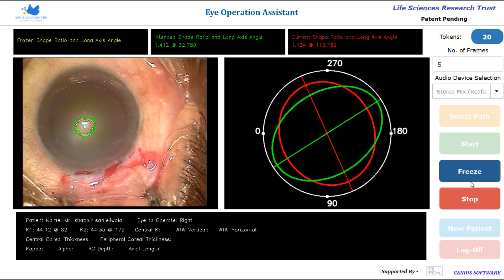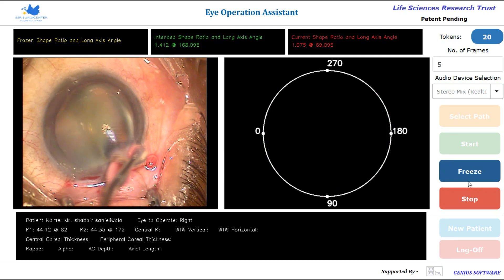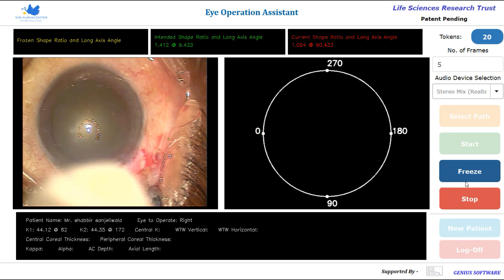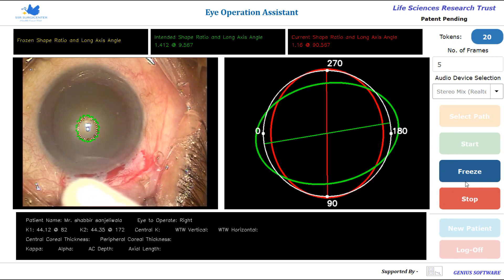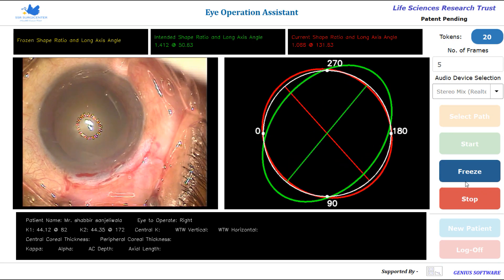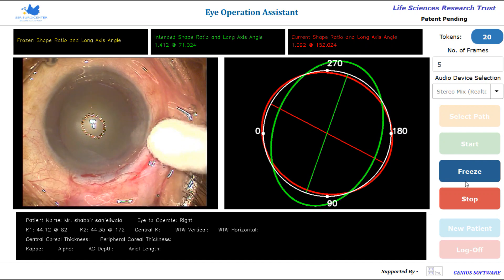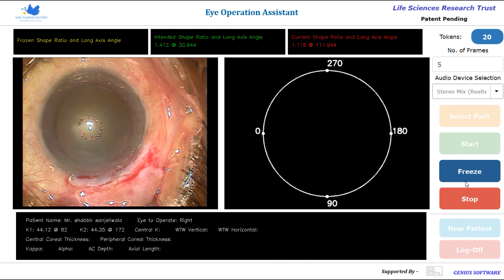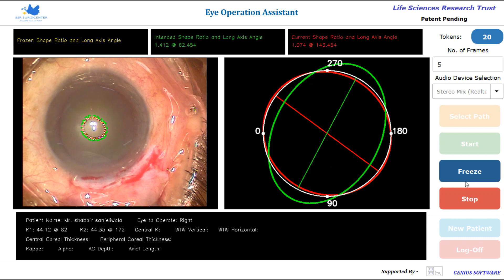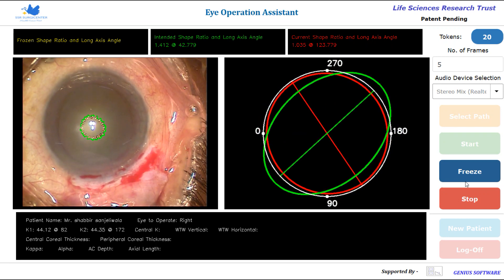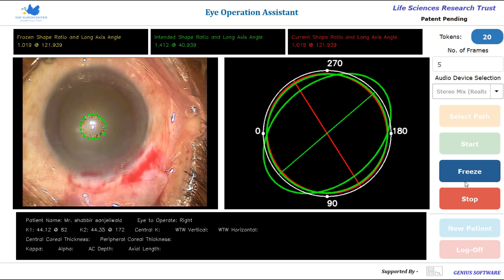The patient is asked to fix on the center of the illuminated keratoscope, which is put on, and when the patient is fixing properly on the center of the illuminated keratoscope, the freeze button is pressed to give the computer a reference image, after which it starts analyzing. Intended shape: 1.41 at 40.